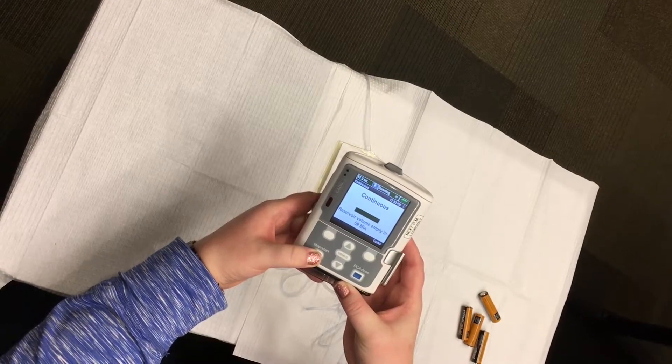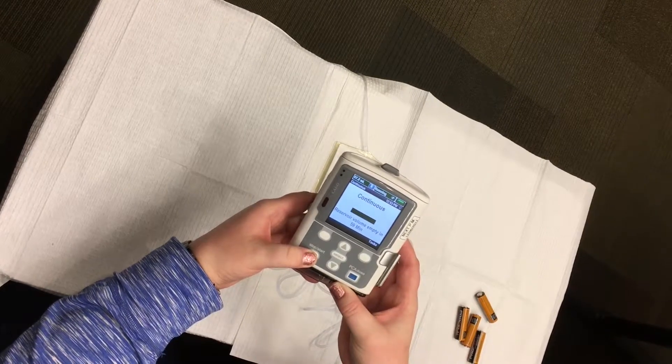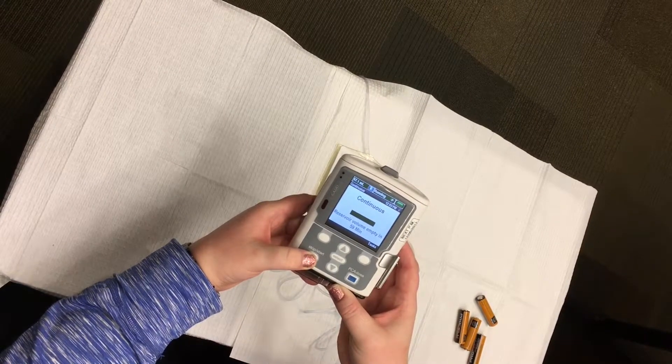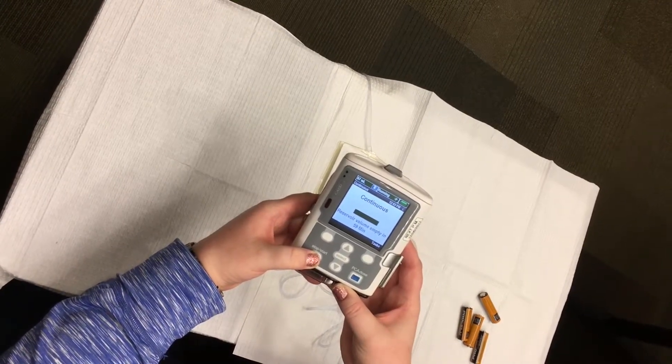Remember to always take extra batteries with you whenever you leave your home. We hope this video serves as a reminder of what your PIPSRN taught you during your admission visit. If you have any further questions or concerns, please call us so we can help.